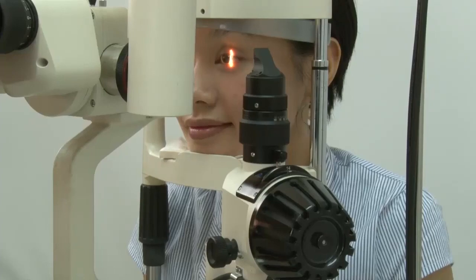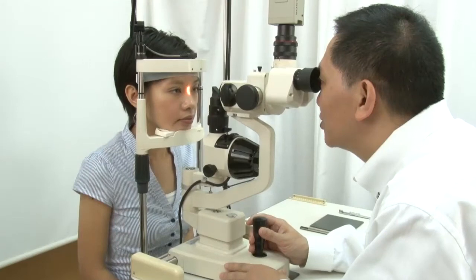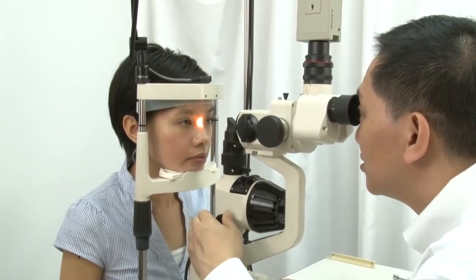All techniques can be interchanged from time to time or even performed at the same time during the examination. It is not required to complete one technique before you move on to another technique.